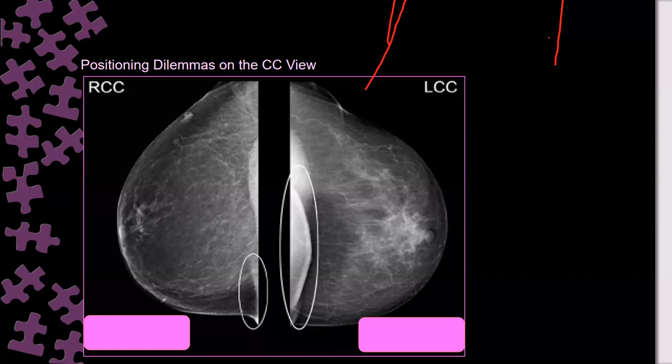The left one, I cannot really commit myself. Because I gave it to you because you commented before. Huda, because you asked before about the cleavage. In the left breast, I couldn't see the medial cleavage. Not well demonstrated, because the nipple is not in profile and not centrally located. And this is the result of what?